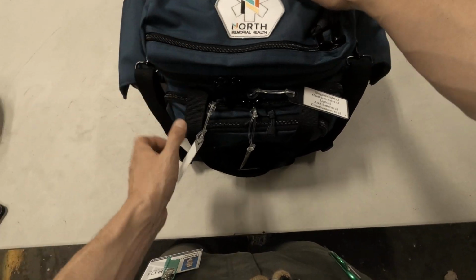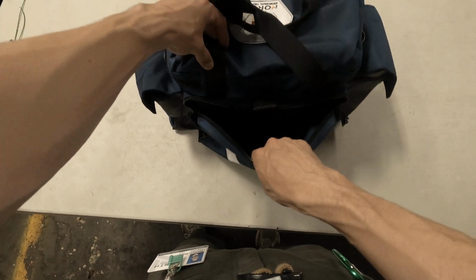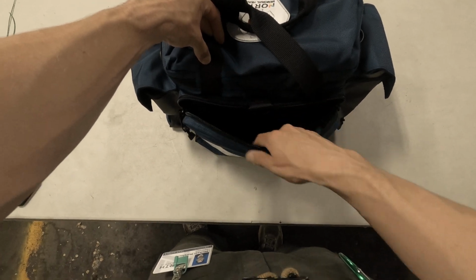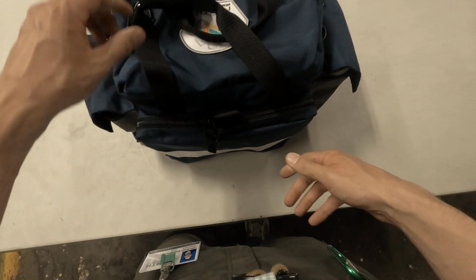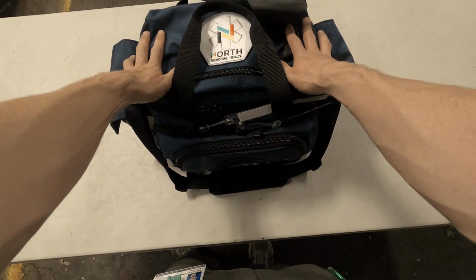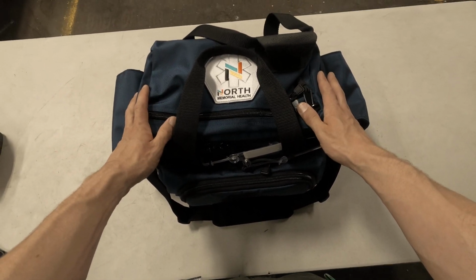So that's really it. There's a couple pockets that are not being used, this front one for example, and the back one. My hope in getting these kinds of bags and getting extra space was that we could add items or equipment to it, like ultrasound eventually. If we can get one that is relatively space efficient, we can put one in here, and we can use that at hospitals or on scenes, whatever the medical directors feel that it would be best used for in critical care. So that's it for the Bleu bag, or the secondary CC bag.